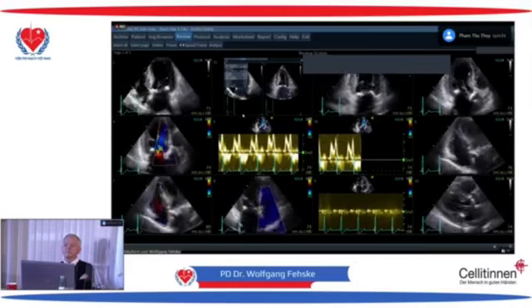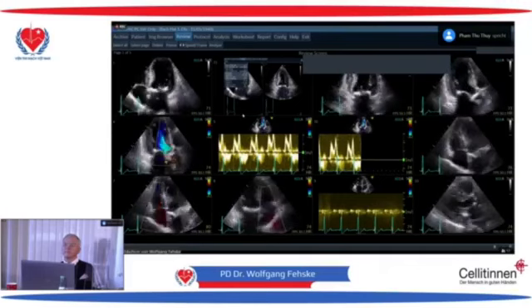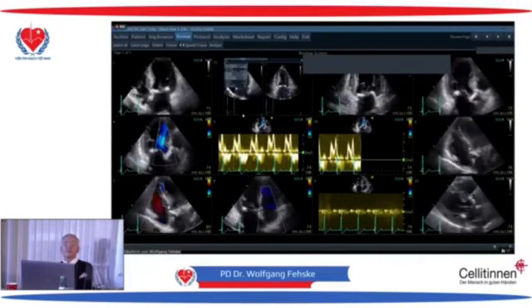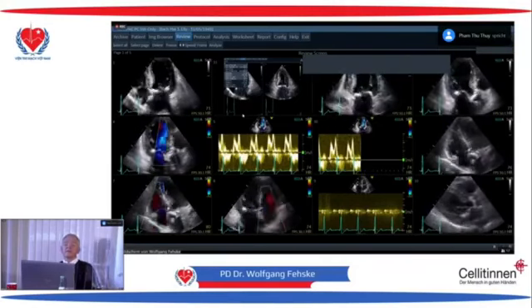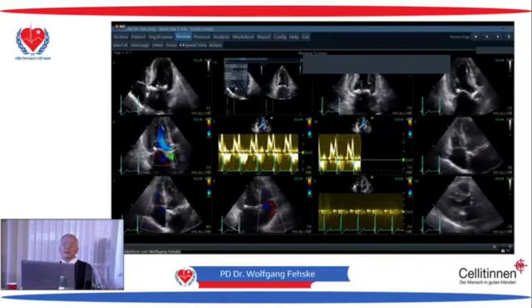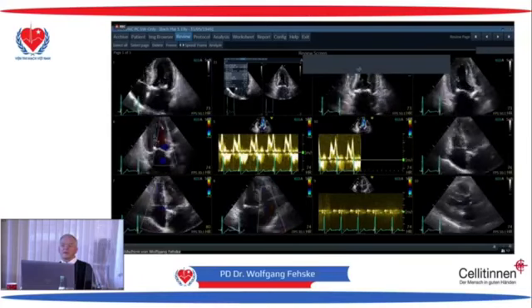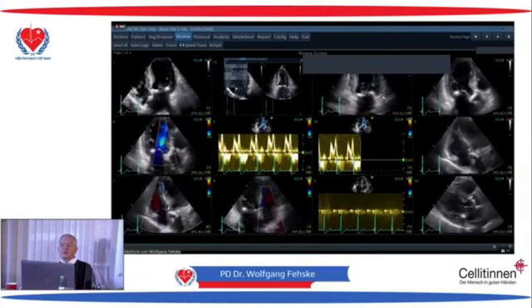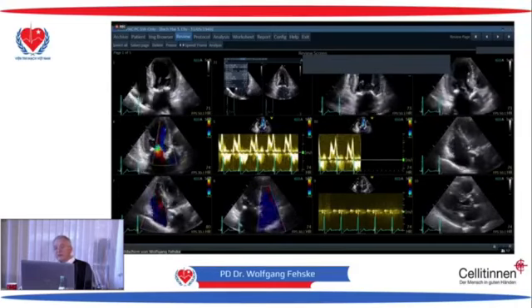This patient, she has a TAVI already? No, she is not yet. Preoperatively. Let's go through it. This is a standard approach. I have 4-chamber, 2-chamber, long axis. It is aortic configuration.